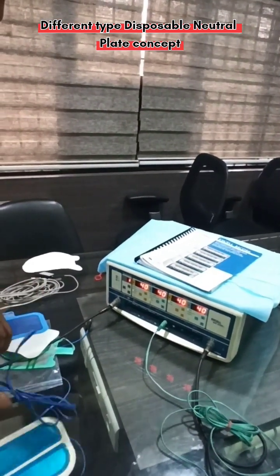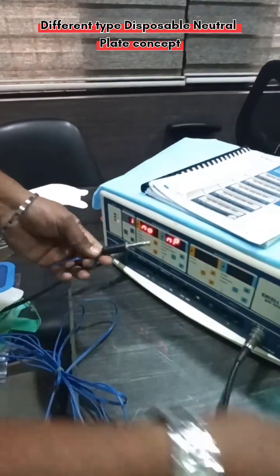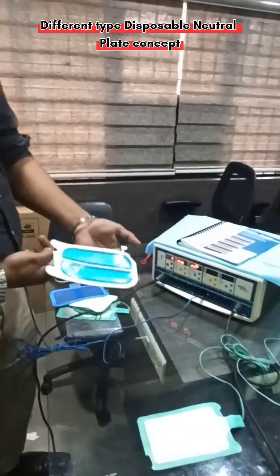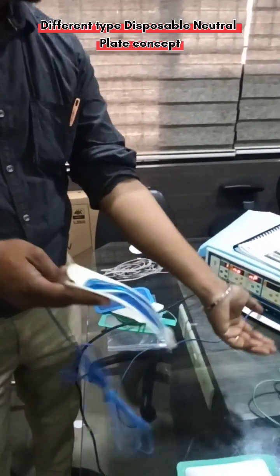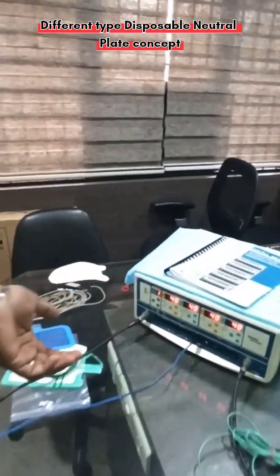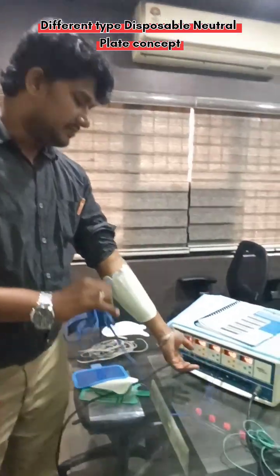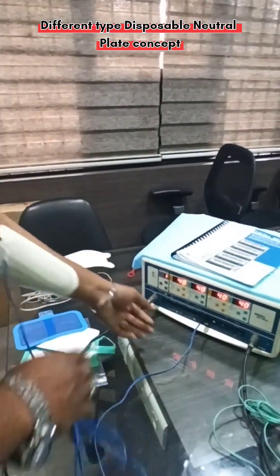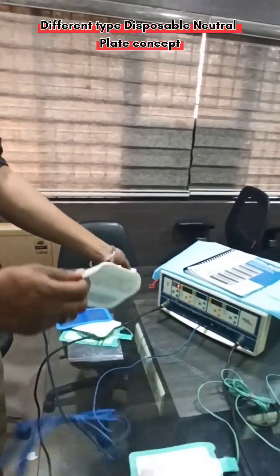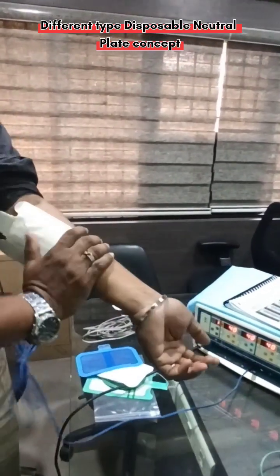Now I am going to demonstrate the split-type earth plate. I am removing this connector and fixing the split-type here. See — I have just connected it, but the error is still showing. With a split-section plate, what you have to do is place it over the patient first — only then will the error stop. After I place it over the patient, the error alarm stops. Otherwise it won't stop. In some cases, staff fix the earth plate but still see 'No NP' showing, meaning the plate is not properly placed on the patient.